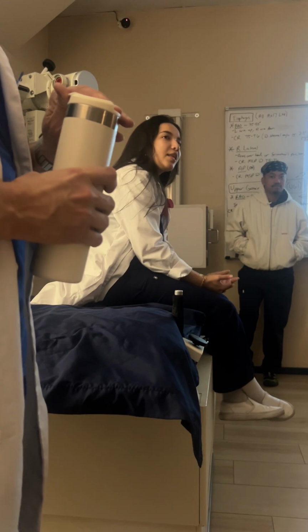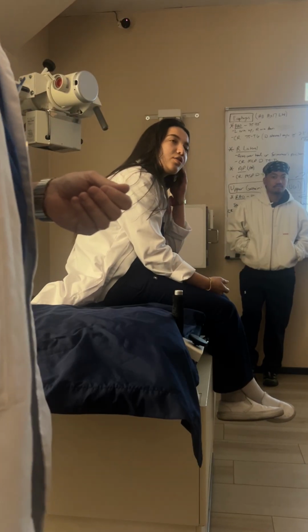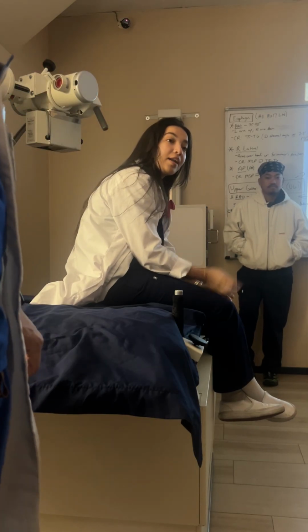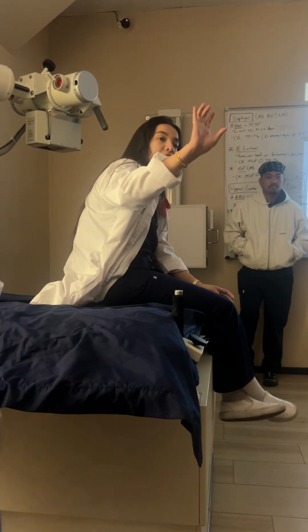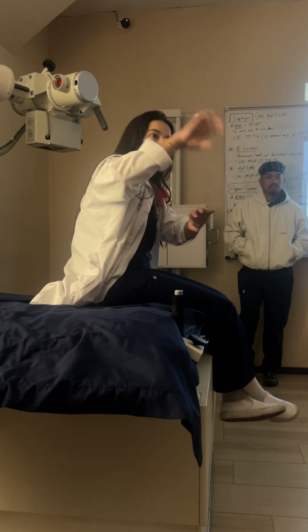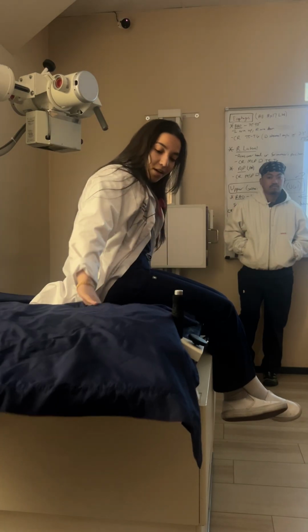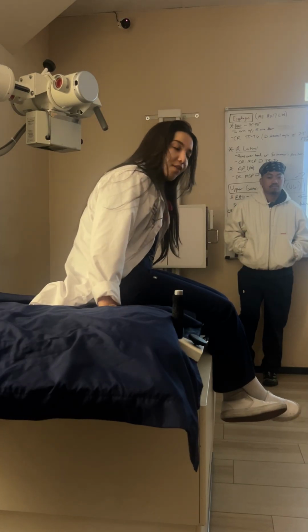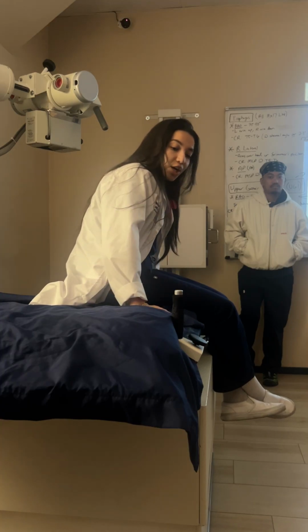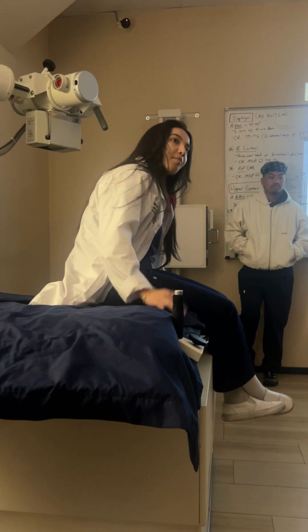Okay, so when they come in, they kind of already know what they're getting into. So I just explain again. I show them the tip. Everything's already ready. Contrast is in. I do an equal amount of contrast to water. So if I put 1 bottle of contrast, 1 bottle of water. I have my table ready. The towels, everything is ready for them. Chucks. Chucks, yes, very important. Tape it down, make sure everything is good. I have their gown ready. I bring them in. I explain it to them. I show them the tip.